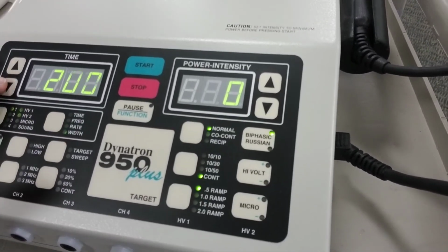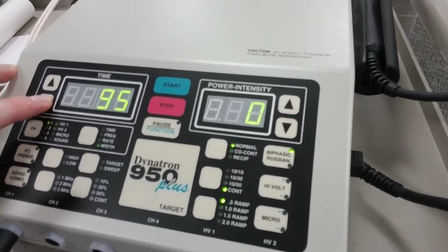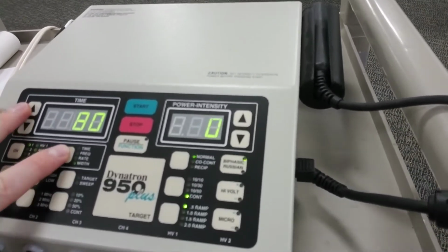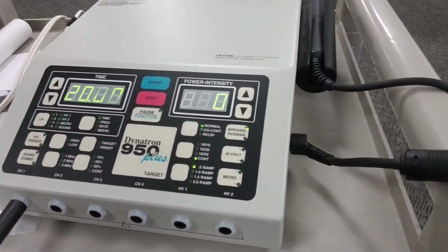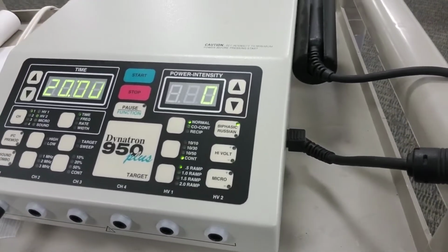And then pulse width, or pulse duration, we want also 80. You can do about 50 to 100, but we definitely want to keep it below 200 because we do not want any muscle contraction. So 20 minutes, 80 pulses per second, 80 microseconds pulse width. And then we'll turn up the intensity after we apply the pads onto the patient.